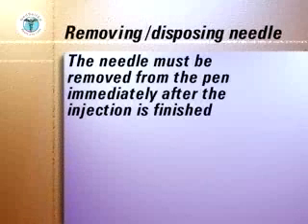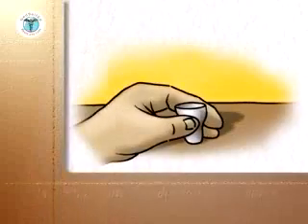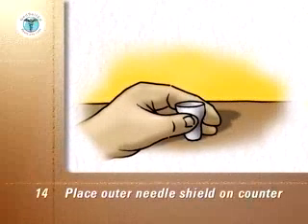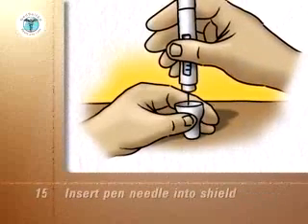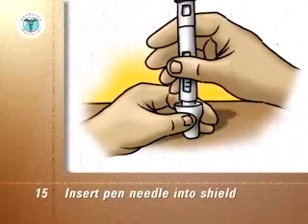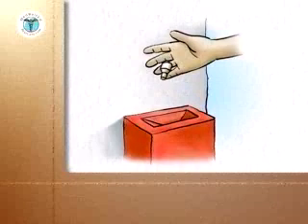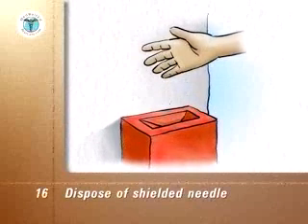The needle must be removed from the pen immediately after the injection is finished. Place the outer needle shield that you have saved on the countertop with the opening face up. Without holding onto the shield, insert the pen needle carefully into the shield and push down firmly. Grip the shield and unscrew the needle from the pen. Dispose of the shield and needle into the puncture proof container that you have reserved for your needles.